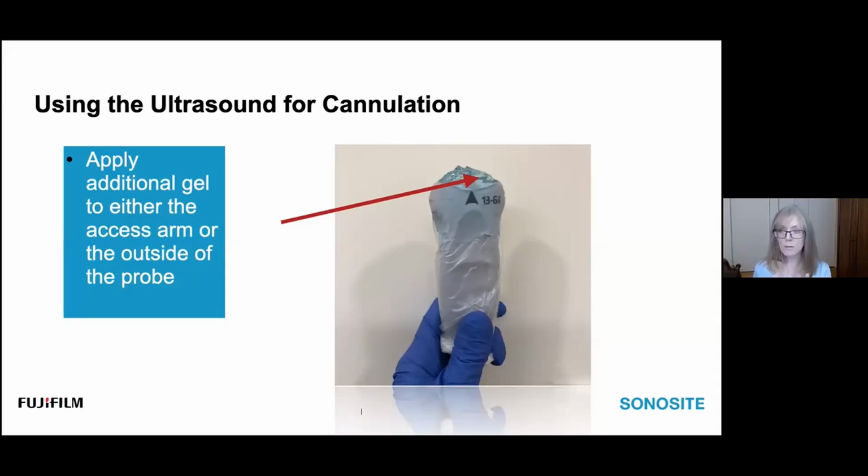It's always prudent to know what your particular facility's infection control parameters are when it comes to the use of the ultrasound in the hemodialysis unit. So it's not simply picking up the machine and running with it and going. It's having robust conversations with other departments about what's the proper way to use this so that we don't put our patients at risk using it.